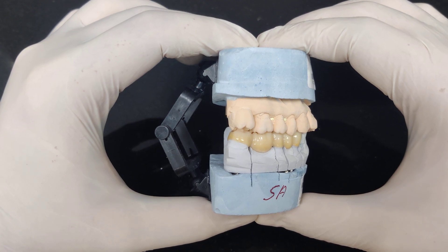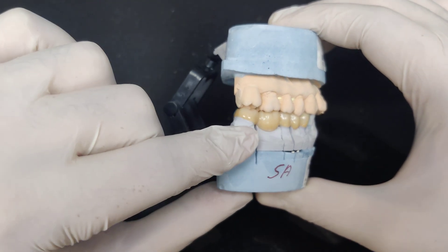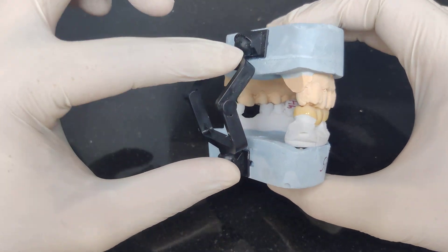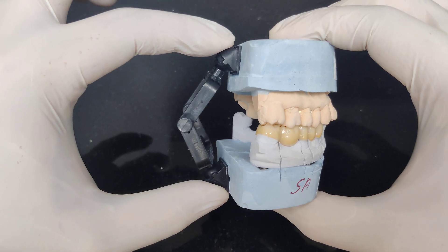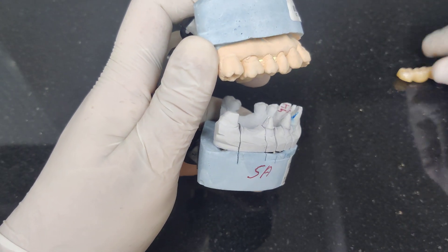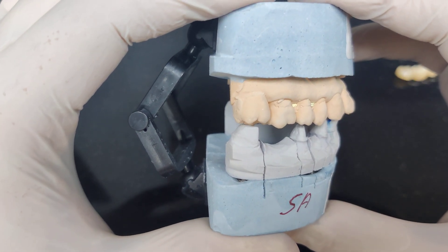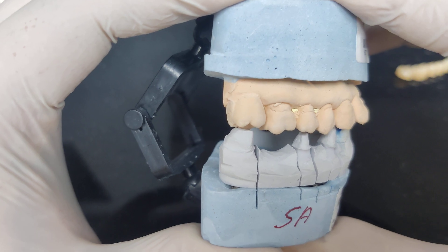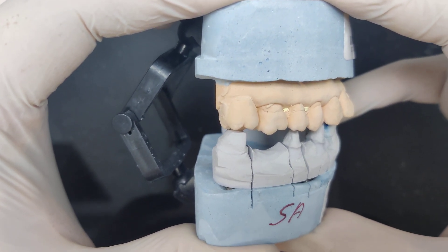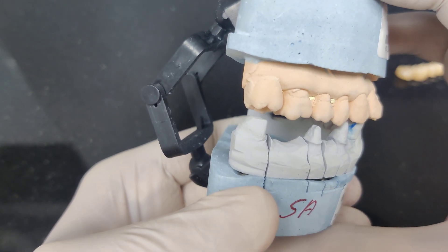Please speak with your laboratory technicians to not fabricate multi-unit cases, especially ones that have a distal extension, on these cheap hinge articulators — these plastic ones. The problem is when I remove this bridge, it seems like there is adequate clearance here, but if I press down, can you see I can decrease the vertical dimension on the very articulator that the laboratory has used to fabricate the prosthesis. This is the vertical at which I have prepared.